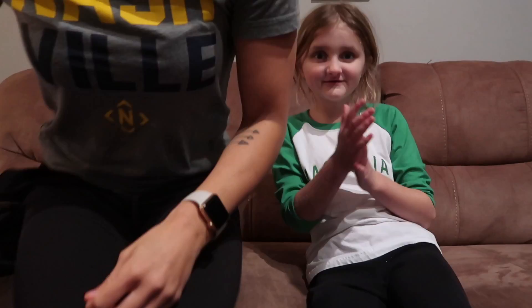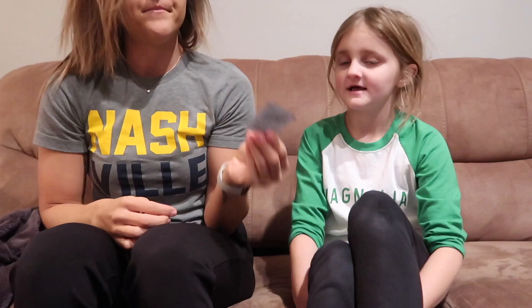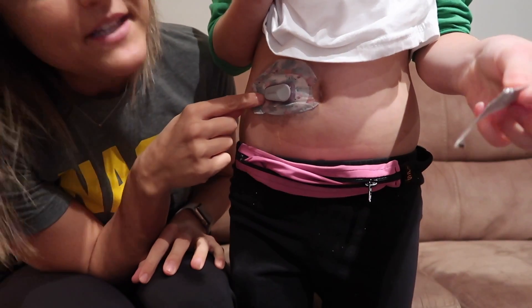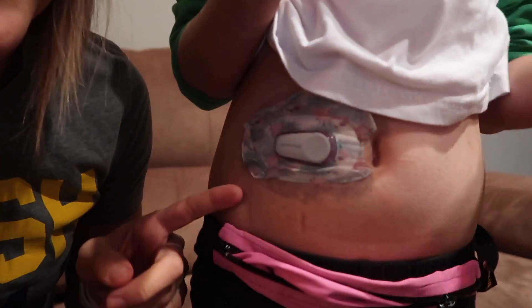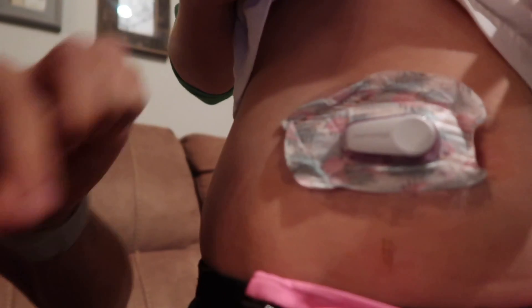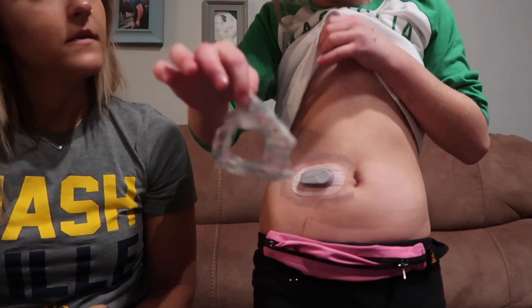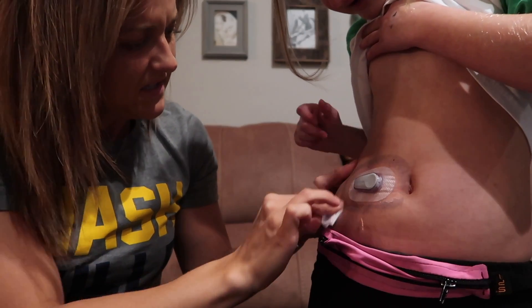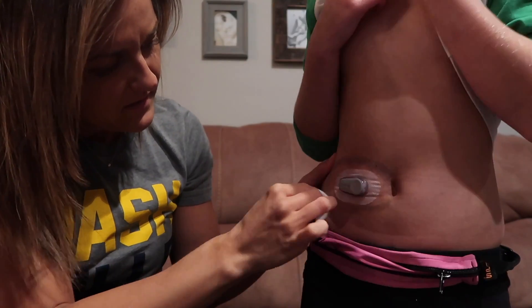So here we are doing it on the couch now. First things first, let's do Dexcom first. As you guys can see, we bought these off Amazon — they are not as good as the Expression Med. Can you see that? It's peeling everywhere. And last time it was probably because of the bath, but the thing I like about this is it just comes off of that part. And see that mark inside? It's like... disgusting.